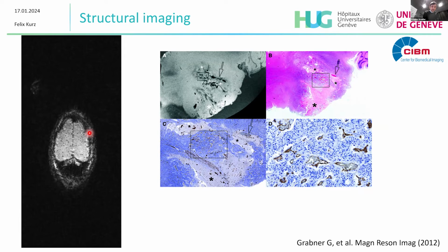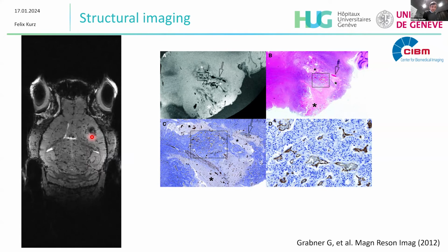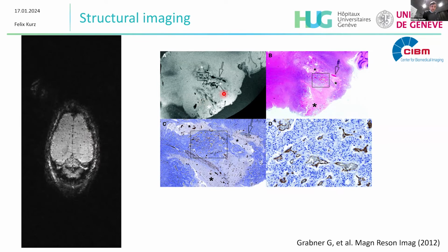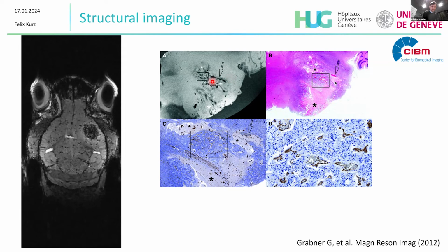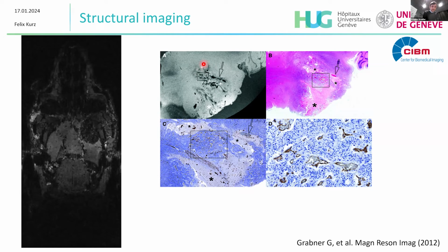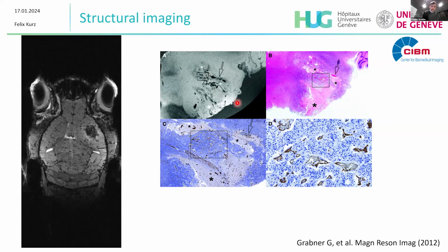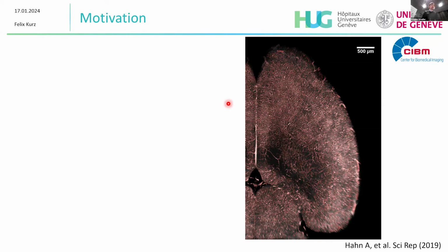Here you see the tumor in the left lower hemisphere, almost completely dark because of all the neovascularization. And this can also be proven histologically, that you have mostly this effect due to the vessels and less due to necrosis, which is here. So in these MRI images, there's almost no, or at least much less signal than for the vasculature. And indeed, we can look at the vasculature.